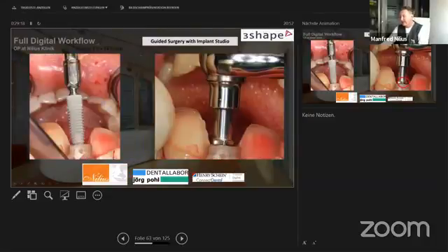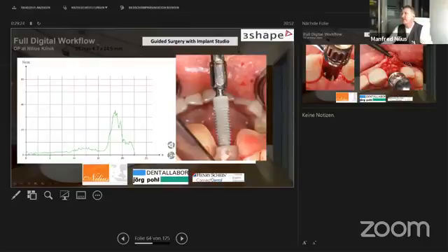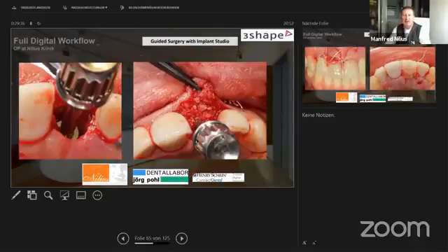And then you put in the implant, have a final check of the Newton centimeters for the force, and if this is less than 30 or 35, you don't load these implants, but in this case it was possible. So the decision is made by you, what kind of implant you use, and then you can say it's possible for loading or it's not possible. I normally tell my patients in the pre-op discussion there is a big possibility, almost 90%, but in case we do not reach sufficient force of the implant in the bone, I will do it the other way. But in this case, it worked quite well.